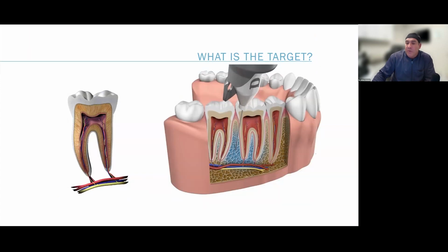So all we're doing that's different with this method of local anesthesia is we're skipping that cortical plate. We're taking that velvet rope off to get into the nightclub right away, and we're delivering targeted anesthesia. I didn't make that term up; I learned it from a colleague, and I find it's an important point: this is targeted delivery of local anesthetic. Where do we need this, right?